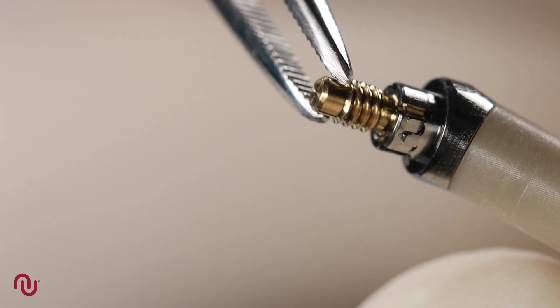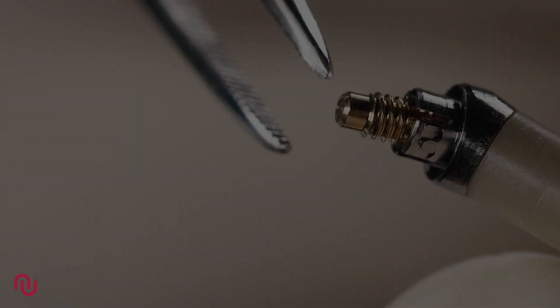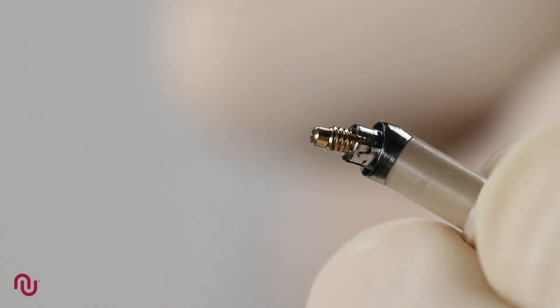Access abutments at 10, 20 and 30 degrees are two-piece, meaning the crystal lock screw is captured within the abutment, whilst the straight access abutments are one-piece.